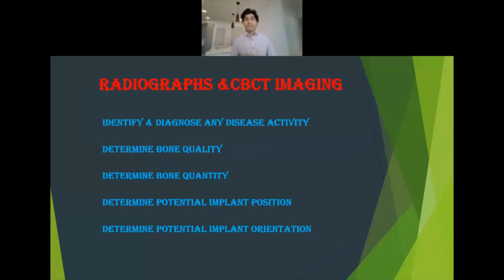Now the second aspect of the guideline is radiographs and CBCT. What's the importance of radiographs and CBCT imaging? It helps identify and diagnose any disease activity. It also determines the bone quality and quantity. Also, it determines the potential implant position and orientation.